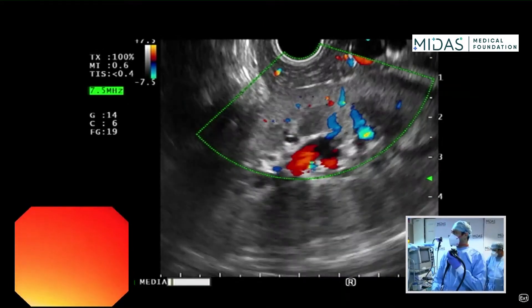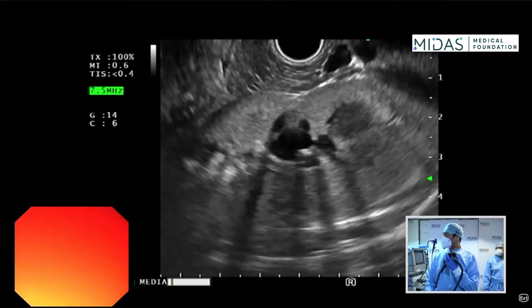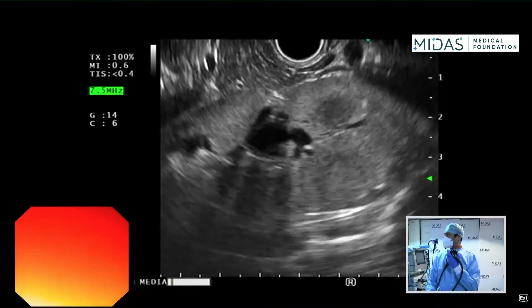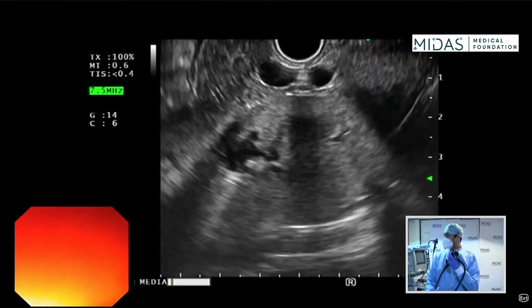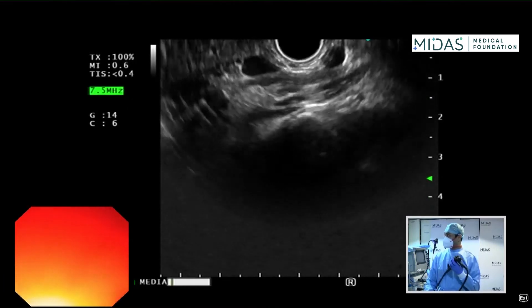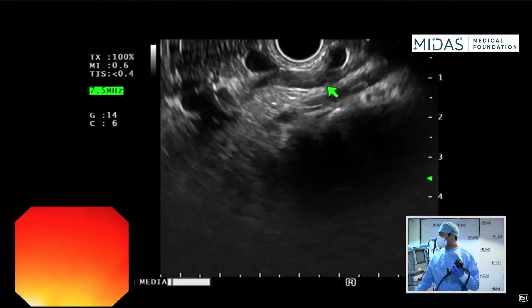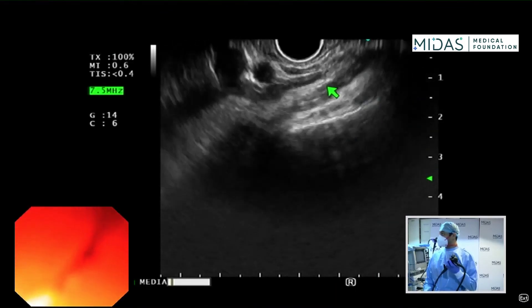When you are at the kidney, another important structure to identify is the adrenal gland. Pull back a little and do slight motions. Between the kidney and the spleen, there is the adrenal gland. At the kidney position, do a slight counter-clockwise motion with big wheel towards me. This structure here — this is the adrenal gland. It's a seagull-shaped structure right there. Now I'm getting nice views of the adrenal gland.